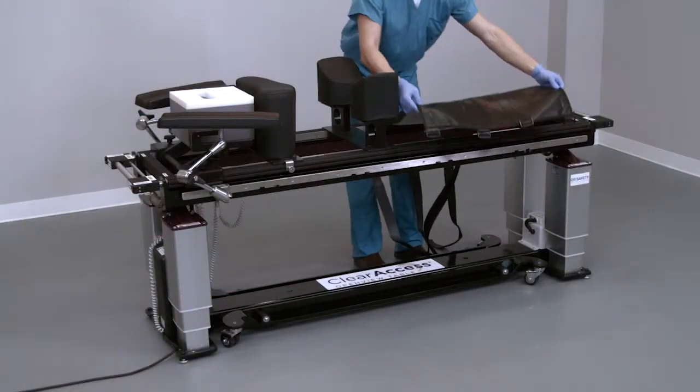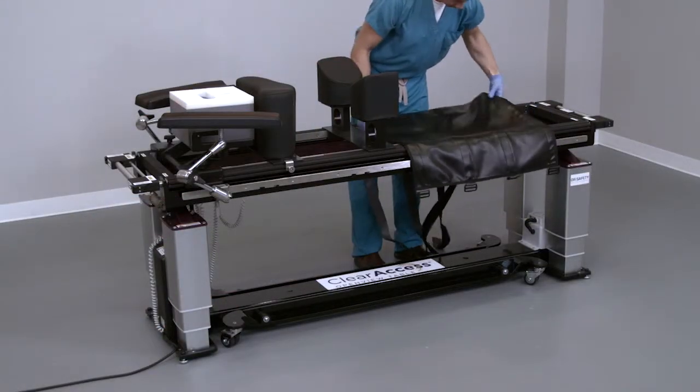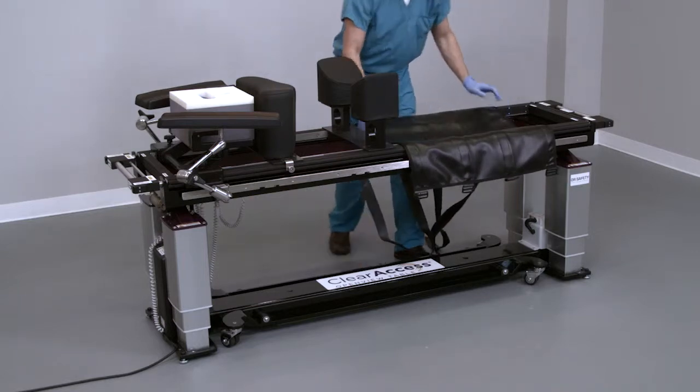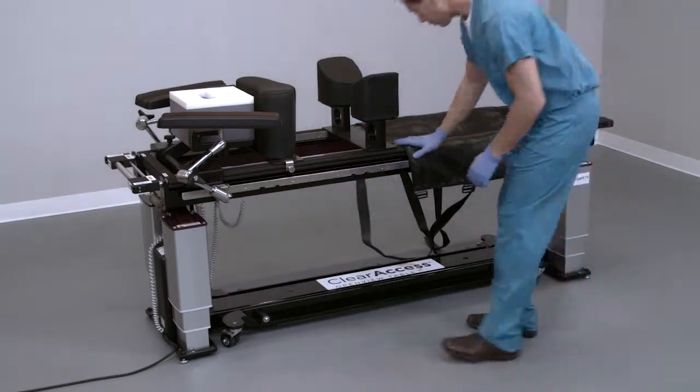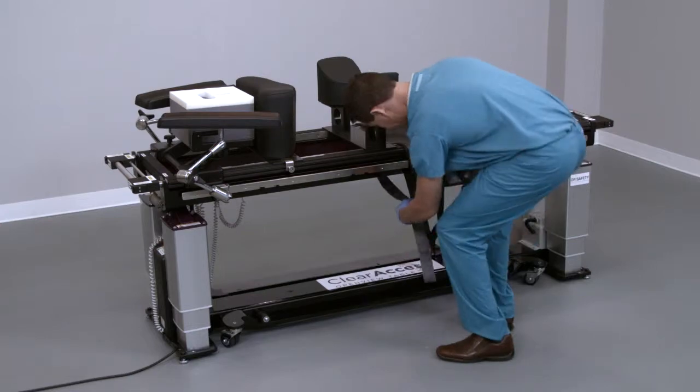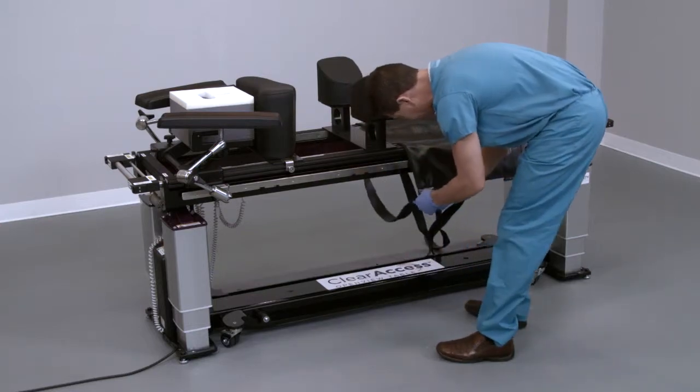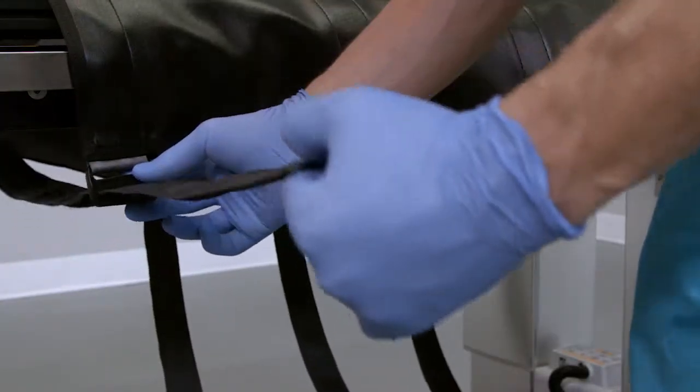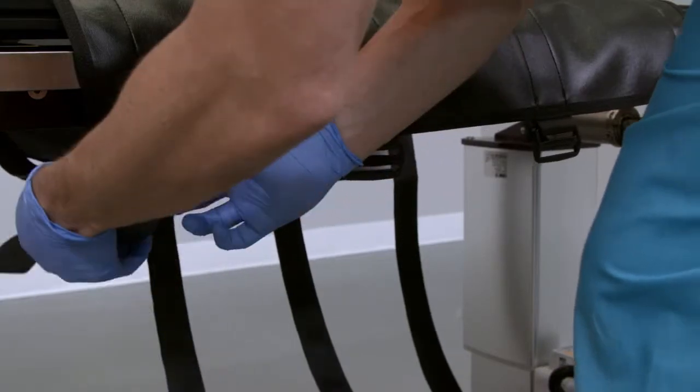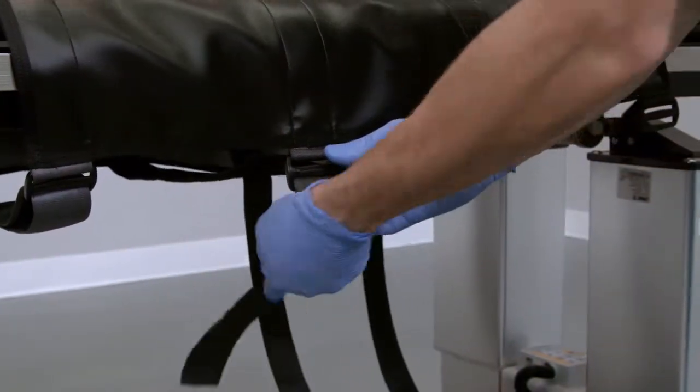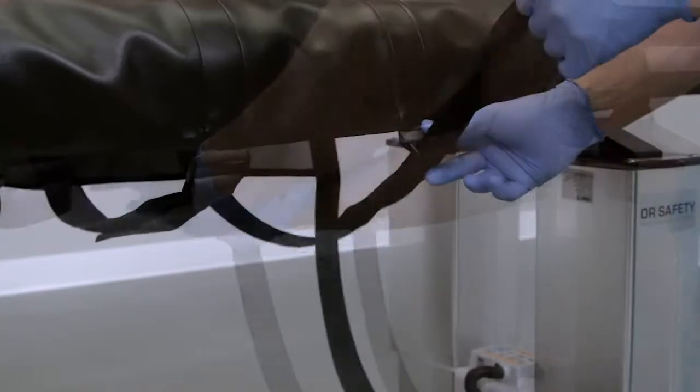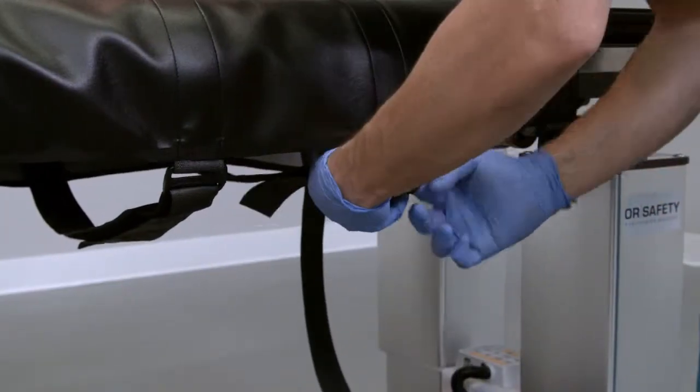To install an adjustable leg sling, wrap the straps around the foot end section of the ClearAccess table. Feed the four straps through their respective buckles on the opposite side of the sling and secure. The sling can be adjusted for each patient. The straps on the sling consist of a double-sided hook and loop closure that allows for continuous adjustment along the length of the strap.